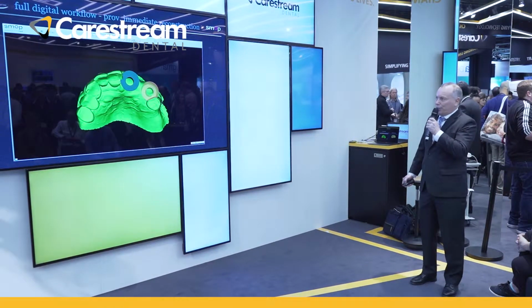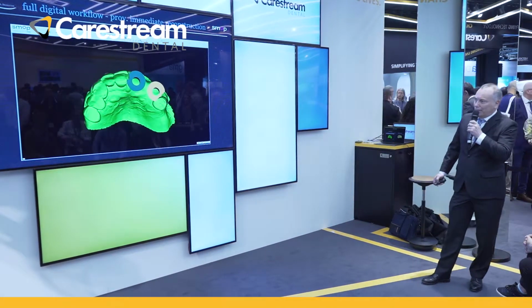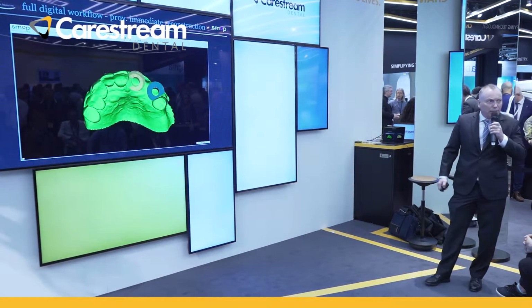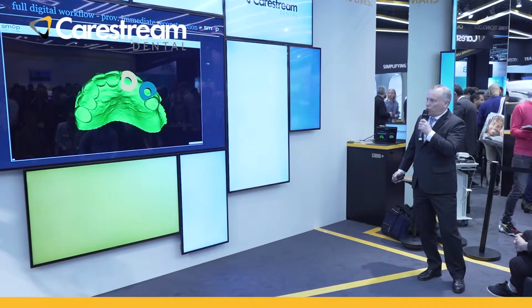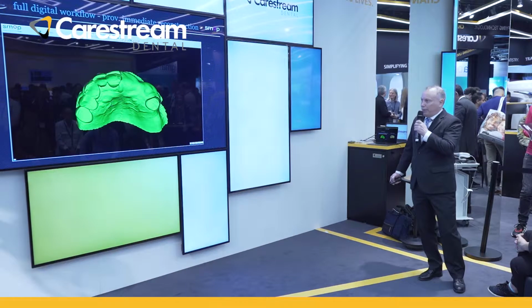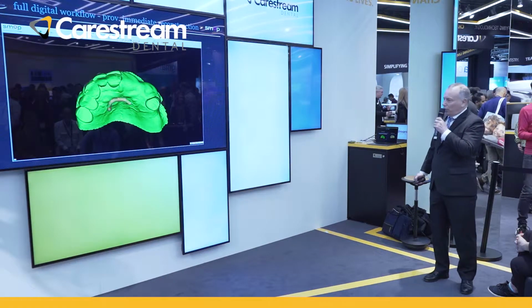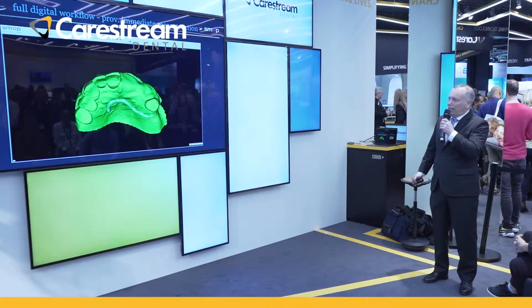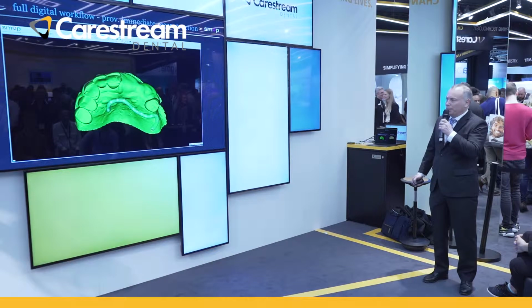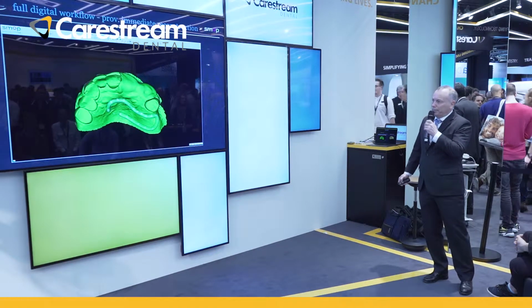We have the sleeves. We can change the form of these sleeves and slice them a little bit. I do not want them to touch the neighboring teeth. In this case, I wanted to have gingival support to have more stability, because it will be an immediate reconstruction. So we create this gingiva support.